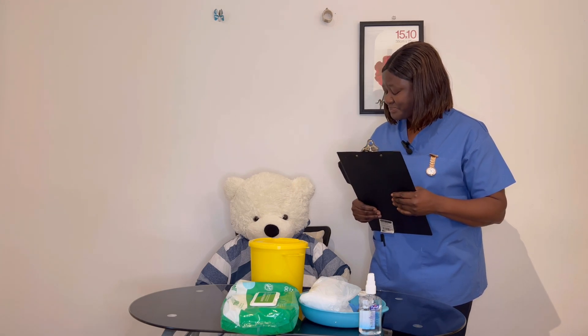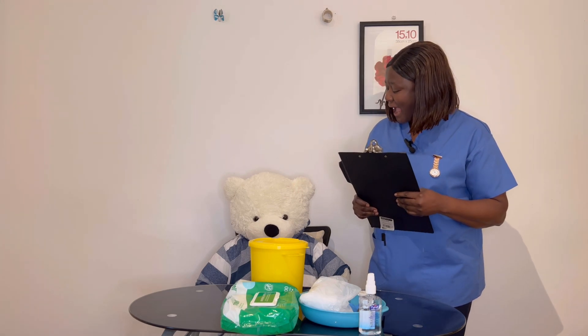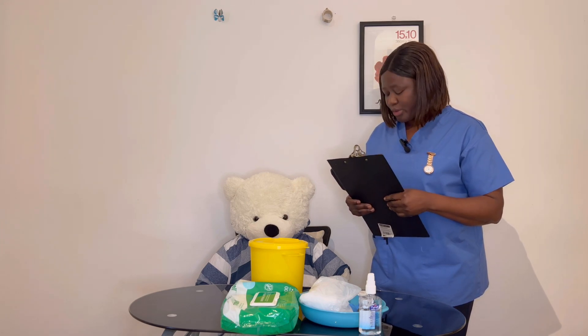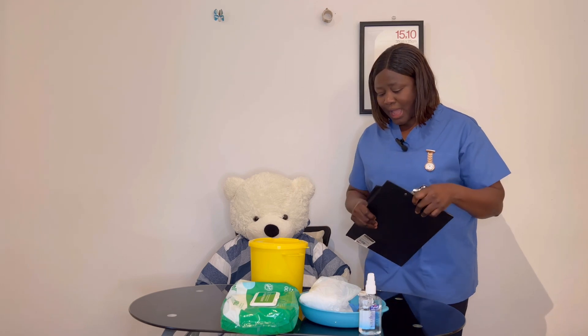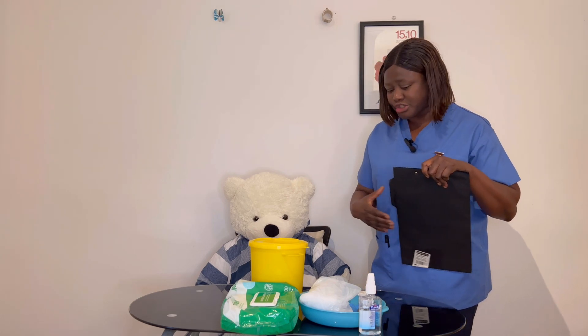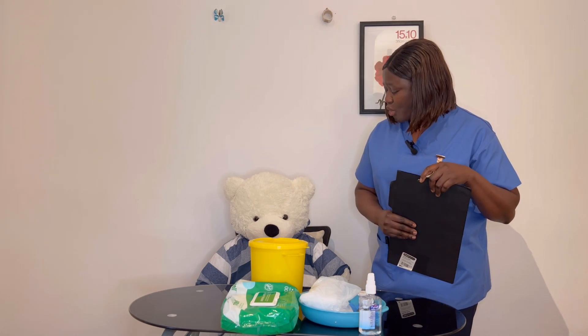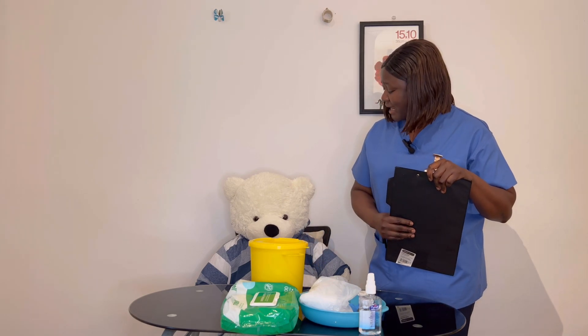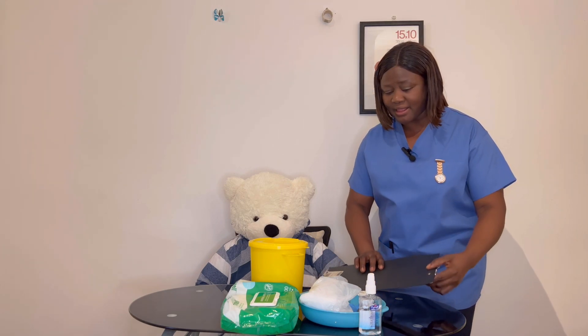Is that okay with you? Yes, thank you. Are you comfortable at the moment or are you in any form of pain? No, I'm all right. I'll be leaving you just to get the materials we need for the blood glucose check. Is that okay with you? Yes. Here's the call bell — if you need me, just press the bell and I'll be right back.